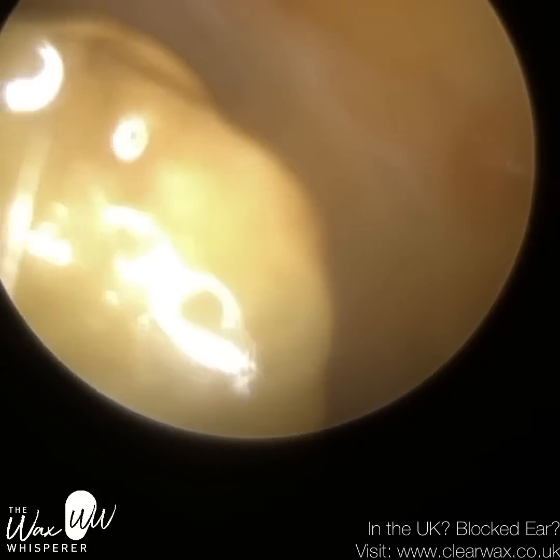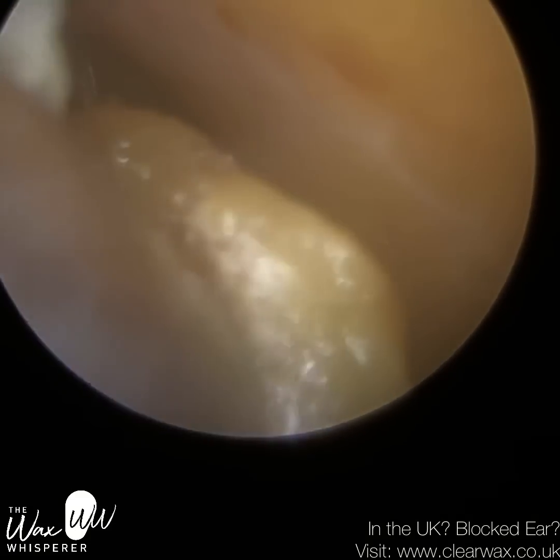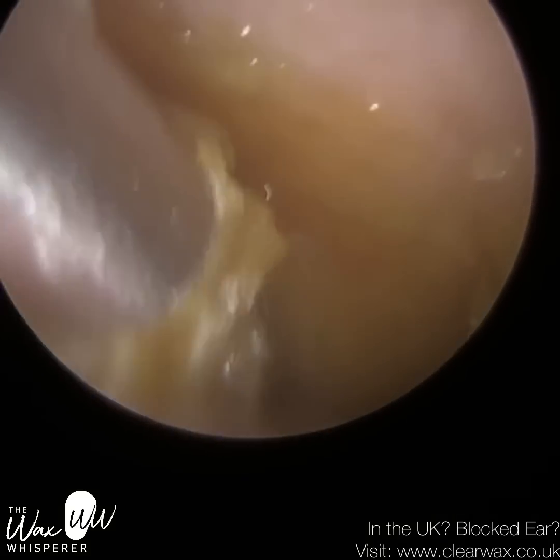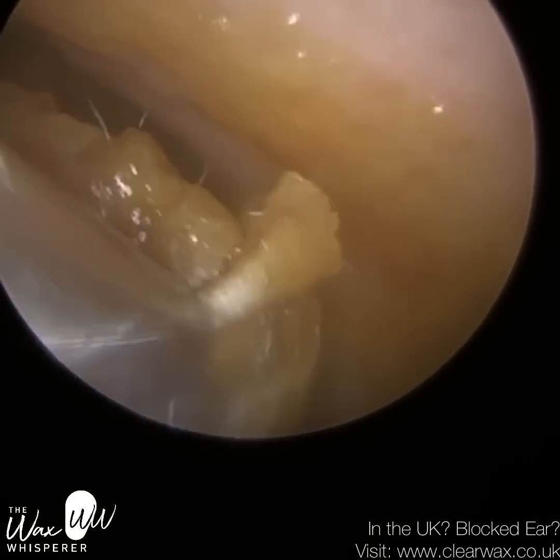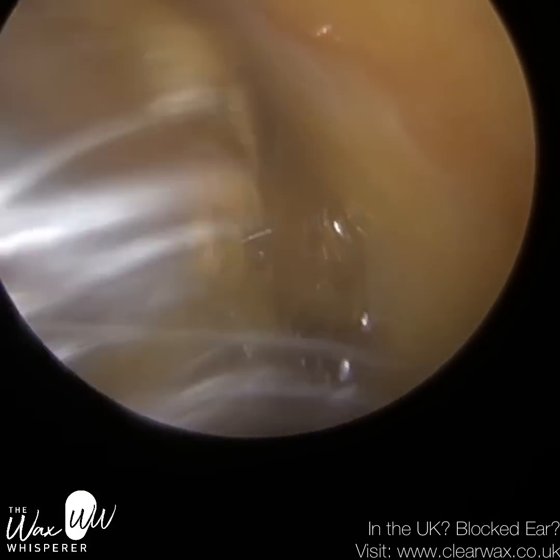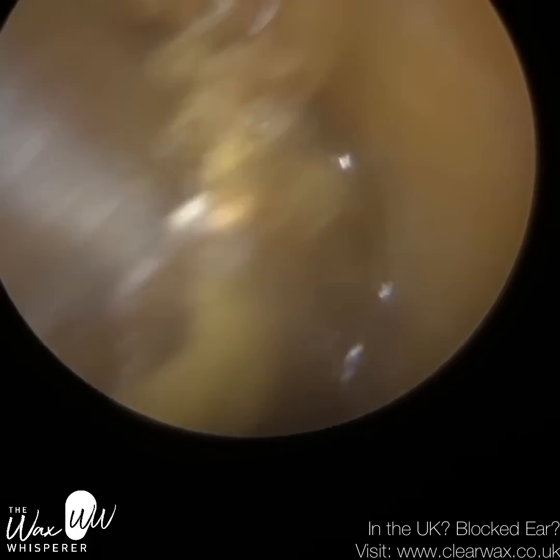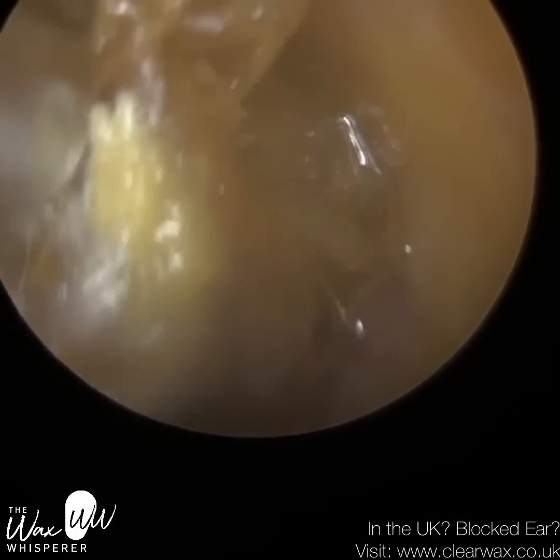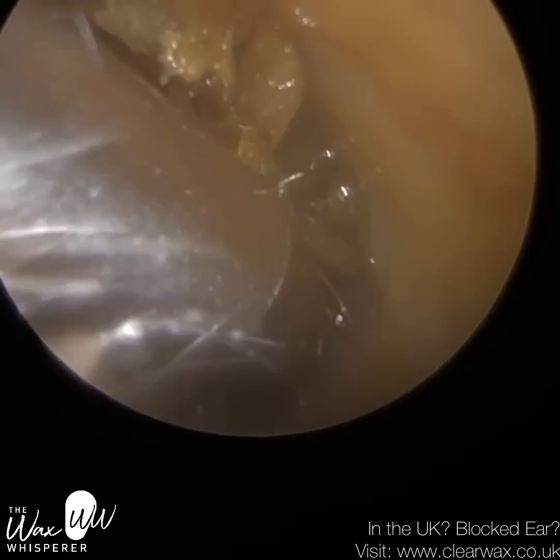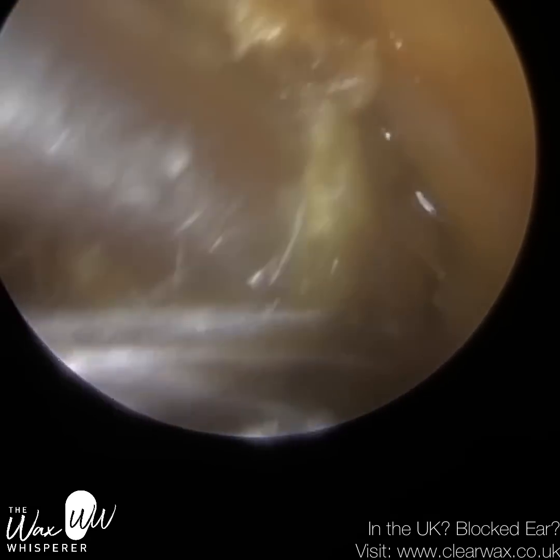This is a patient who attended with a severely blocked right ear, and I examined the ear prior to performing the procedure, and you could see it was really blocked. This patient preferred to lay horizontal on the couch to have the procedure performed, and normally all my patients are sat upright in a normal posture, but this patient felt more comfortable laying down.